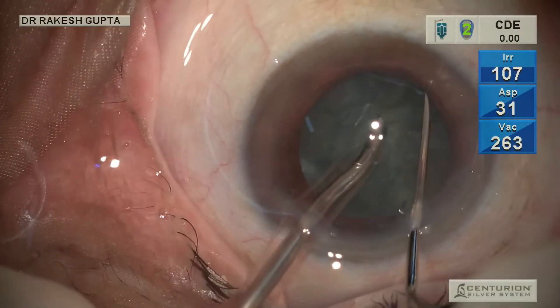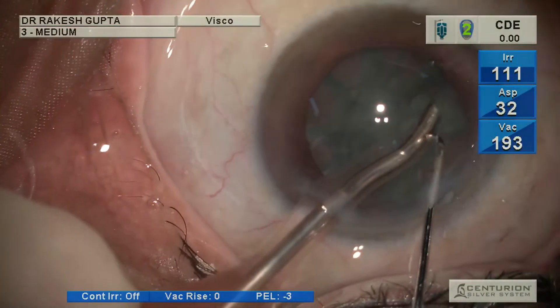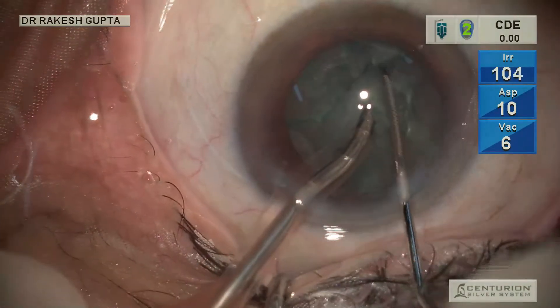This technique is useful in patients with cataract up to grade 2 nuclear sclerosis — all soft cataracts, all grade 1 nuclear sclerotic cataracts, all subcapsular cataracts, and up to grade 2 nuclear sclerotic cataract can be done with this technique.